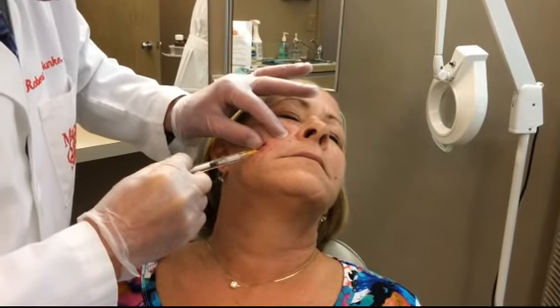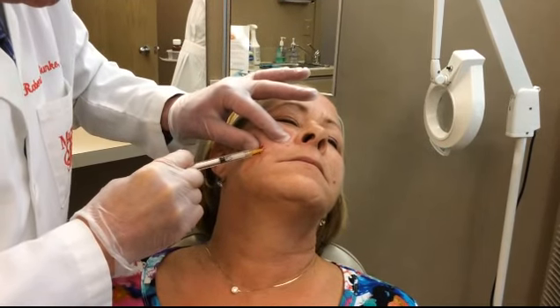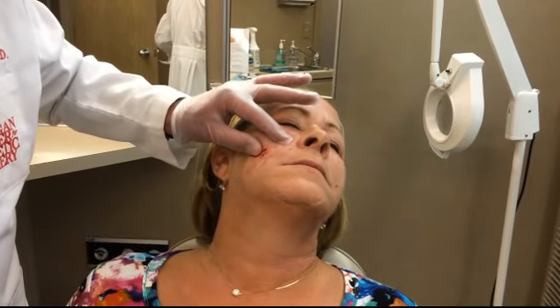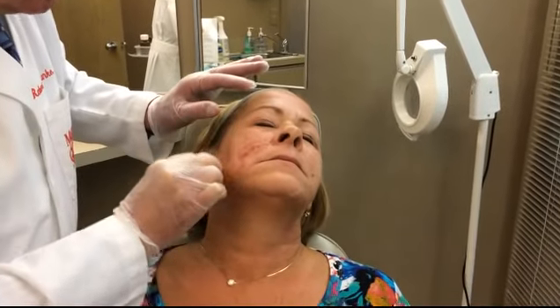So this is the area we're concentrating on. I'm going to massage this a little bit from the inside — put my finger in your mouth — and massage it to work it around the scar.